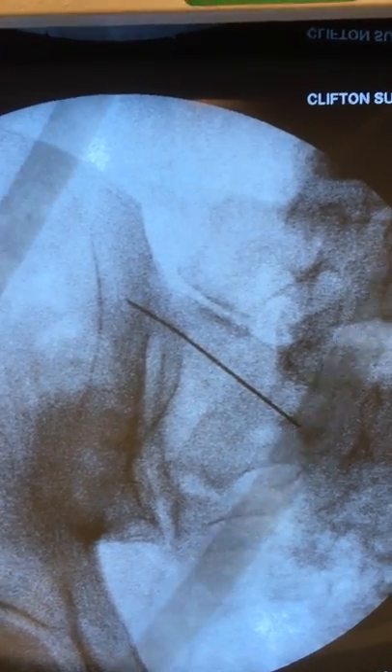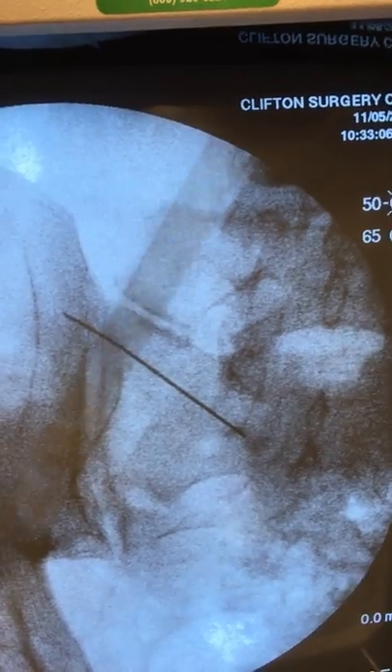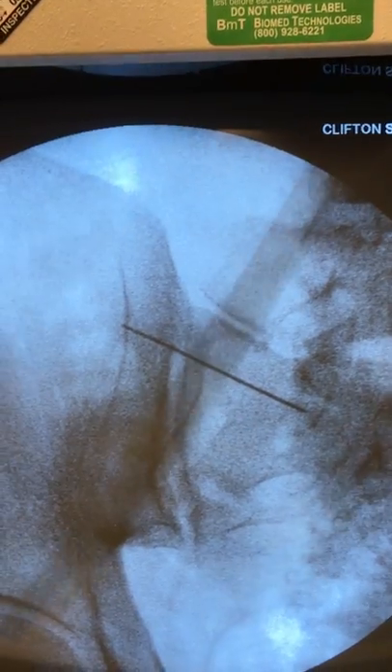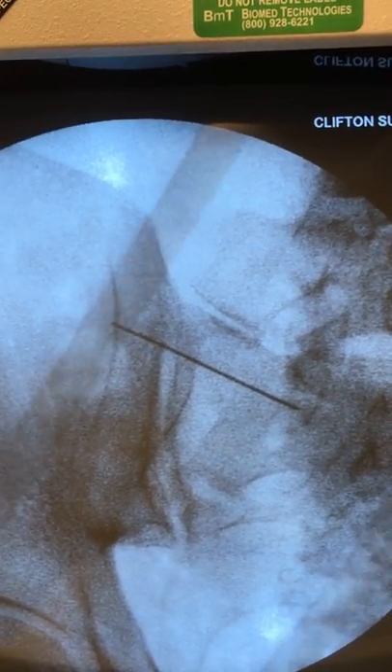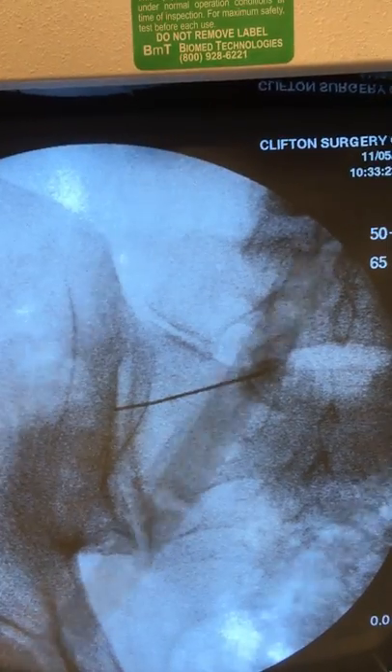Here you see at the S1 level the needle is placed in the most superior aspect of the joint for an injection. The needle is then being moved somewhat down to the S2 level, and as the video proceeds, down to the S3 level.